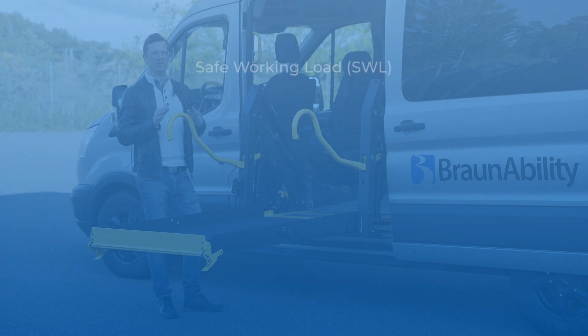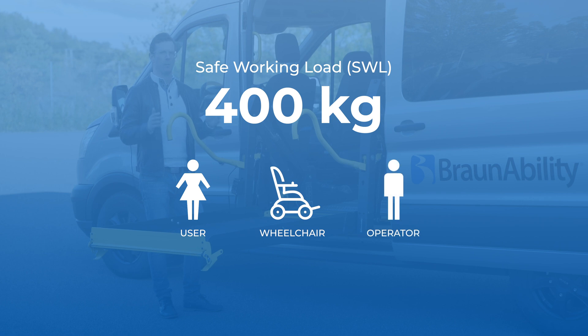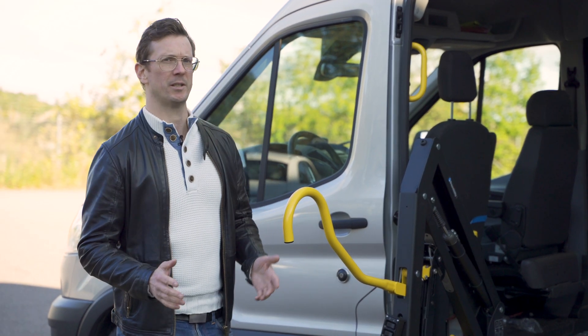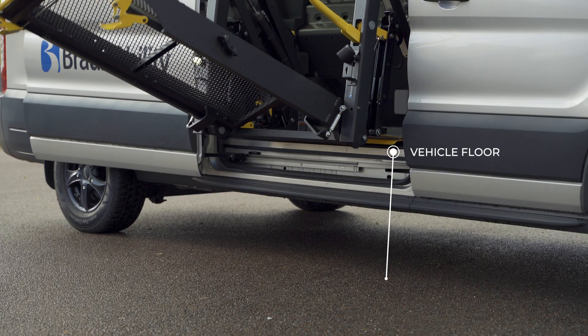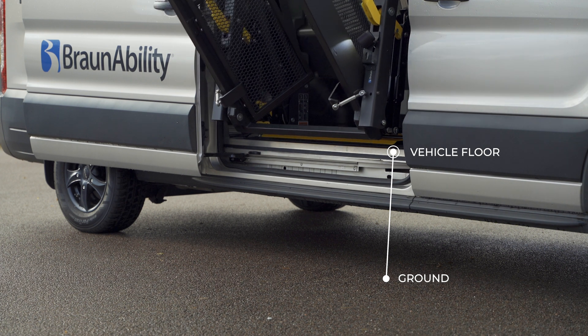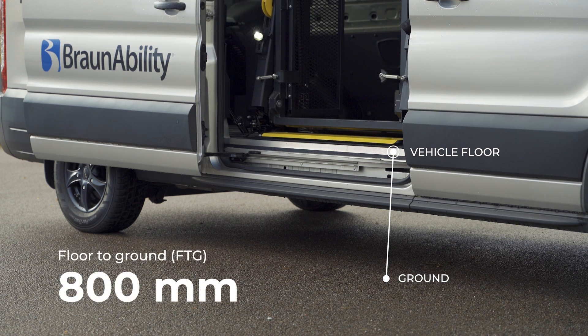The E-Series wheelchair lifts have a safe working load of 400 kilos. This covers the combined weight of a power wheelchair user, their wheelchair and a lift operator. Another standard across the series is the lifting height — the distance between the vehicle floor and the ground. All E-Series lifts have an 800mm floor-to-ground lifting height, which covers any relevant vehicle in the market today.